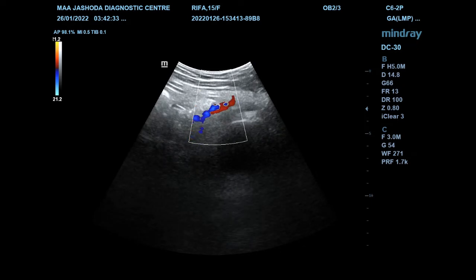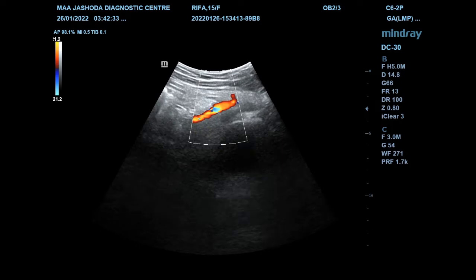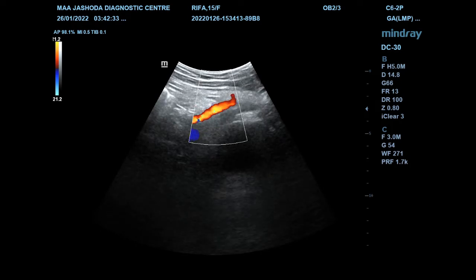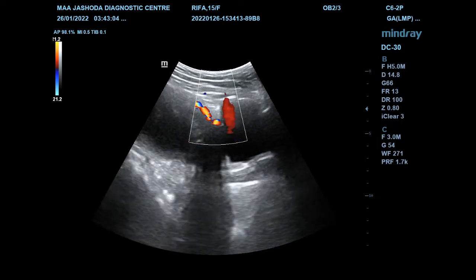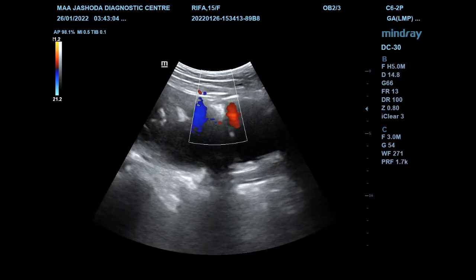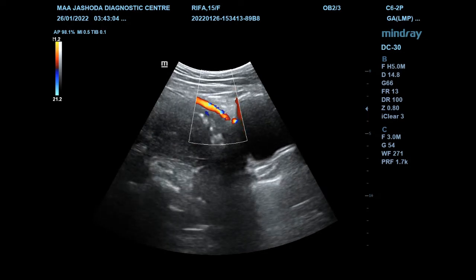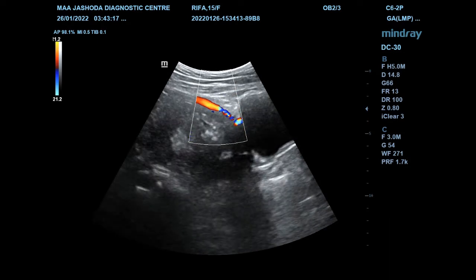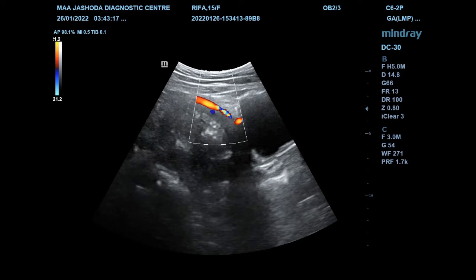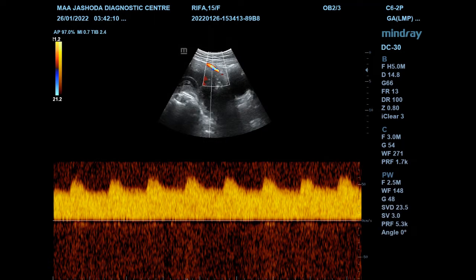Then put the color box and slowly move the probe upwards to get the external iliac vessels. Here, the uterine artery is seen crossing over the external iliac vessels. Put the gate on the uterine artery, and then the typical waveform of the uterine artery is seen.